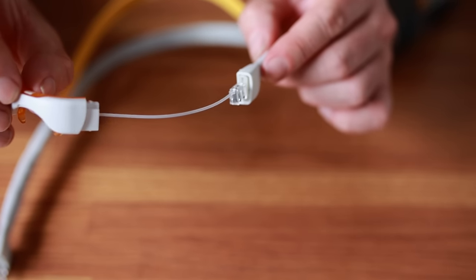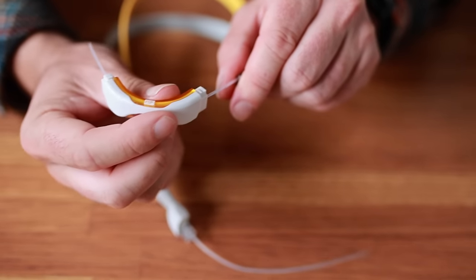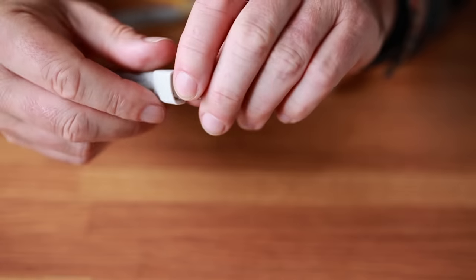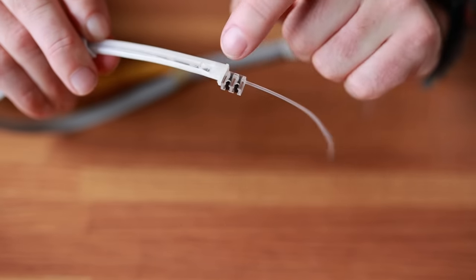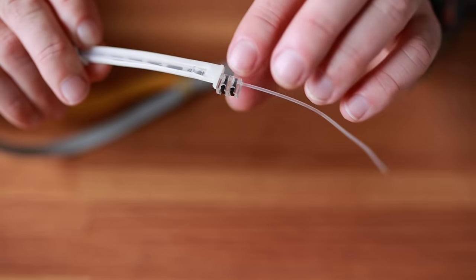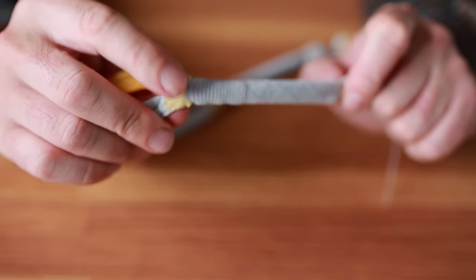So this cable here actually runs through this piece right to the other side — you can see it there as I'm doing that. What happens is this cable, if I pull this back, runs right through here. You can see it turns to this thicker material. That's the same cable — it goes from thin, it's got a little locking mechanism, and then it goes to this thicker cable and it's locked in up here at this point.